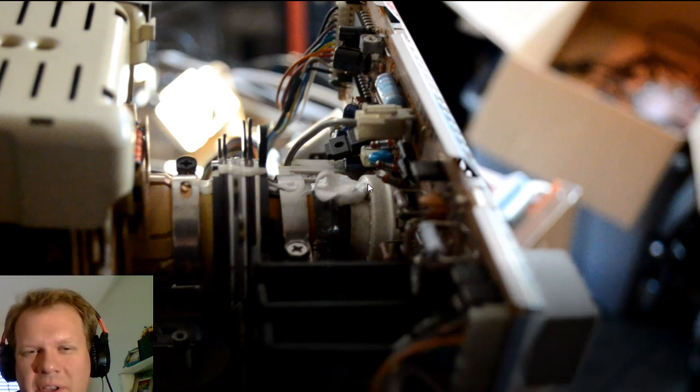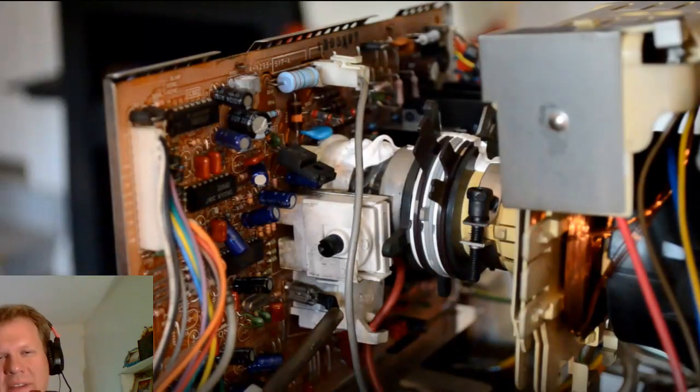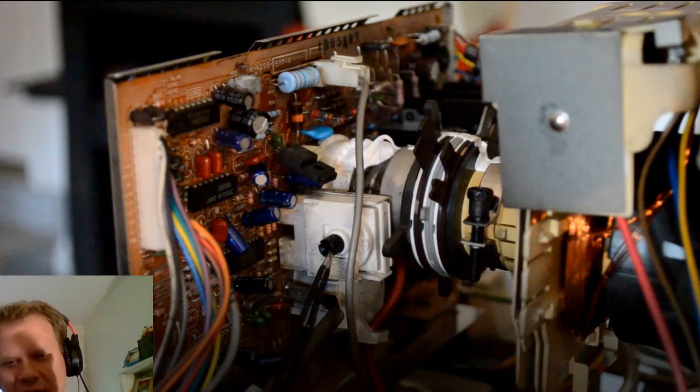And the last thing I do is I will add a little bit of silicone. You see that white silicone right there? To keep the neck board from moving once I put it all back together. And then this is just a walkthrough on these potentiometers.